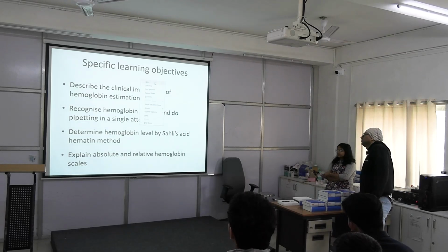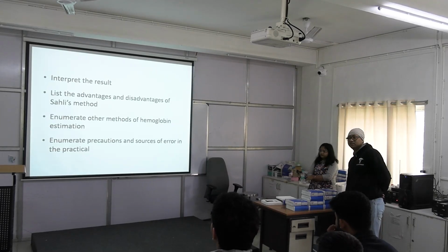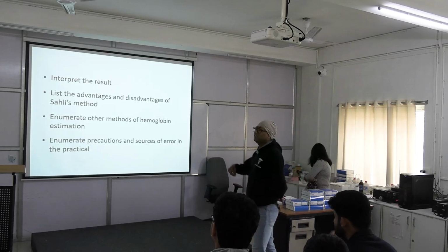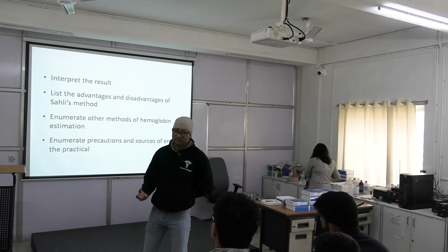Next is interpret the result, and list the advantage and disadvantage of Sahli's method. I just told you that Sahli's method is an old method, a very primitive method of hemoglobin estimation, and it is not accurate. Still we will learn it.